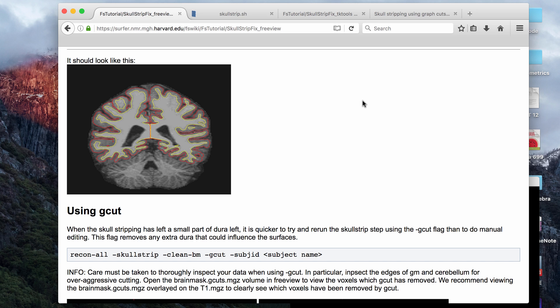FreeSurfer has a couple of commands that you can try to run to fix the brain mask before you do any manual edits. If you think your brain mask has a lot of errors, I would recommend first that you try the commands, then look at the brain mask that was produced by these commands, and then if there's still problems, do manual edits on those brain masks.